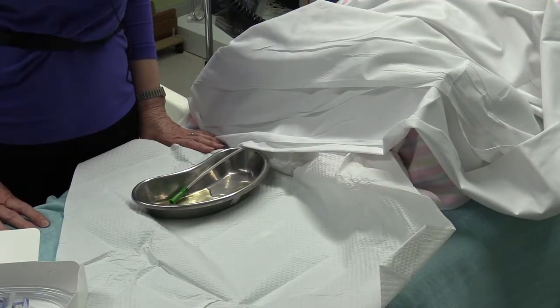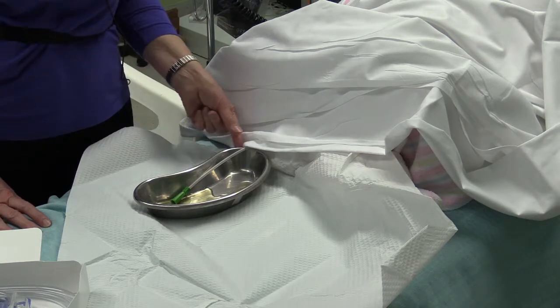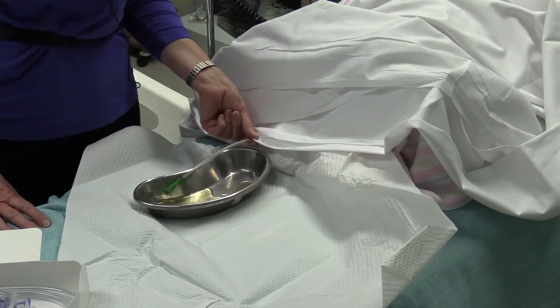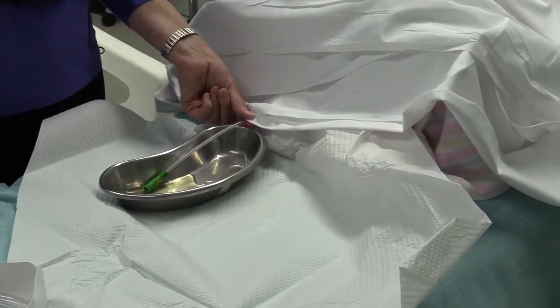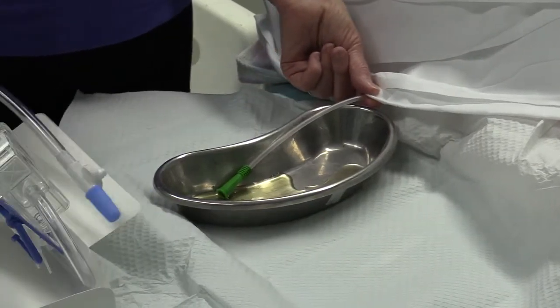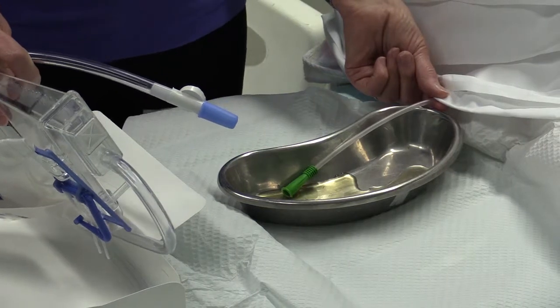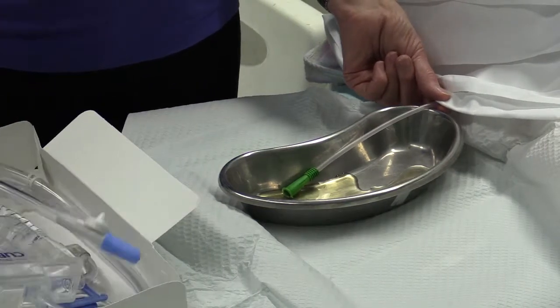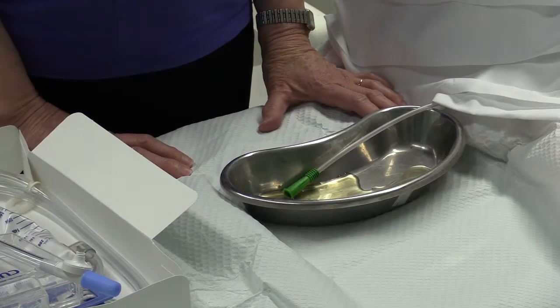Before insertion of the peritoneal dialysis catheter, it's very important to make sure that the bladder is completely empty with the insertion of a bladder catheter, either as an acute in-out catheter or attached to a drain bag. This will ensure that the child's bladder is completely empty and there is no risk of introducing the catheter into the bladder at the time of insertion.